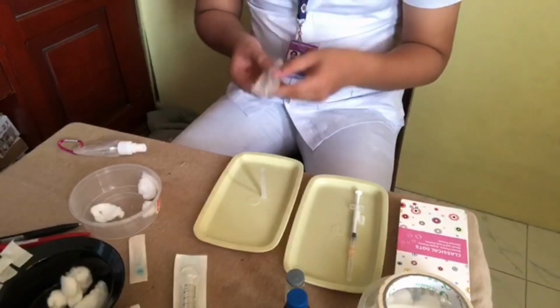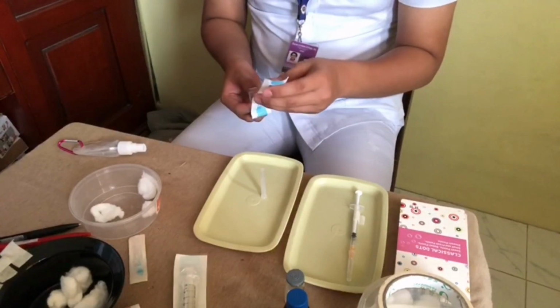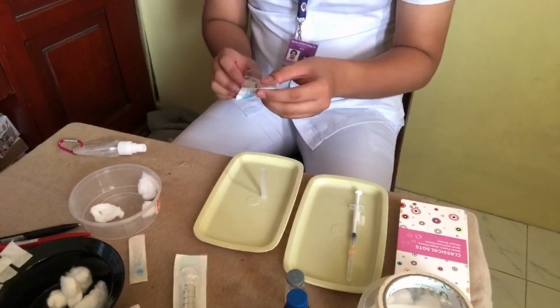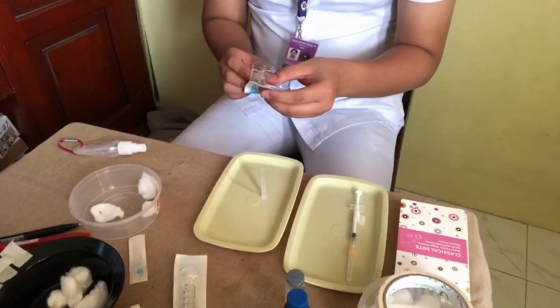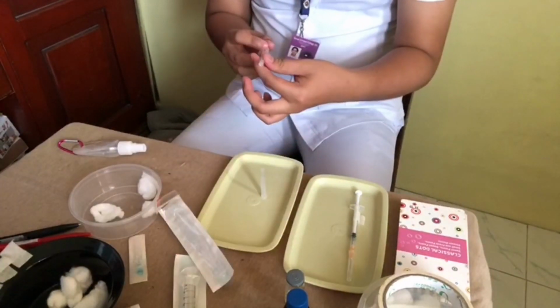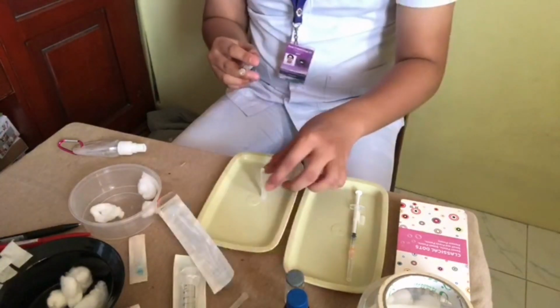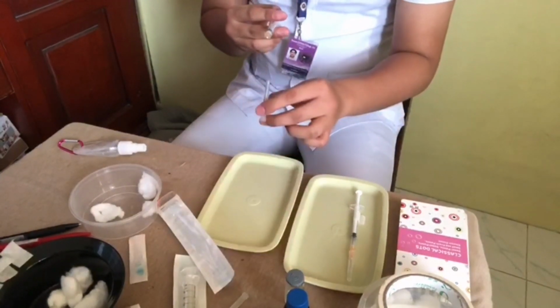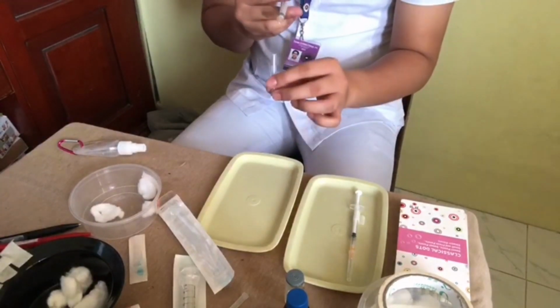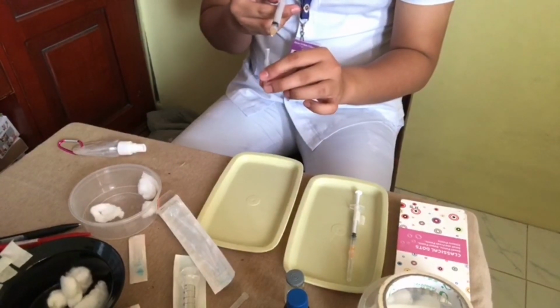So now we'll remove the cap from the filter needle and insert the needle into the center of the ampule, being careful not to touch the rim of the ampule with the needle tip or shaft to avoid contamination. And then we'll now withdraw the amount of the medication needed.